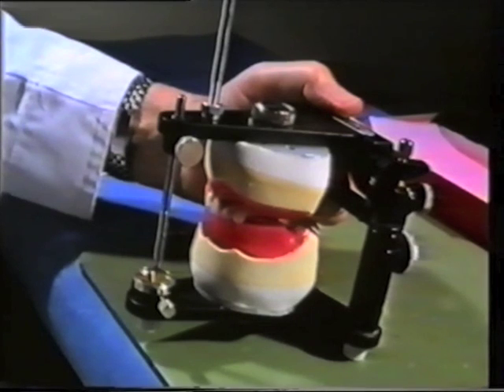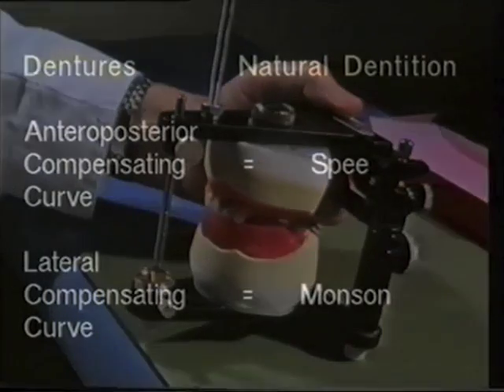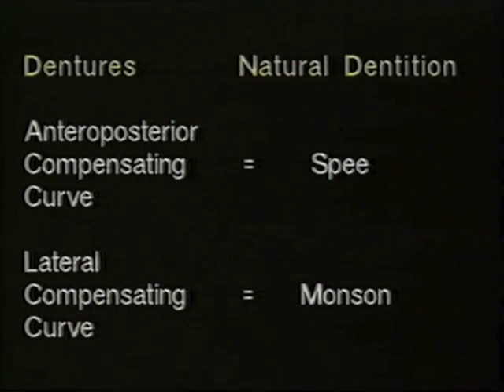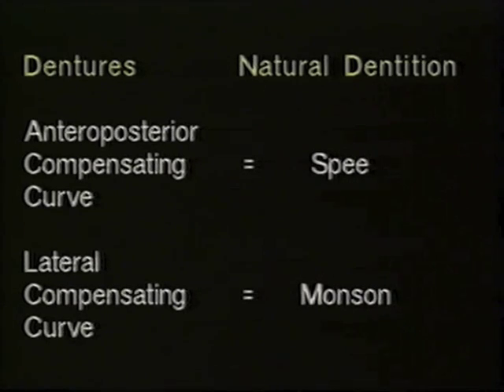The maxillary posterior teeth must be carefully positioned to maintain maximum occlusal contact with the lower teeth, not only in the intercuspal position, but also during lateral and protrusive functional movements. To achieve this objective, the teeth are arranged so that their cusps form a series of compensating curves. These curves consist of an antero-posterior compensating curve analogous to the curve of Spee observed in the natural dentition, and a lateral compensating curve or curve of Monson.